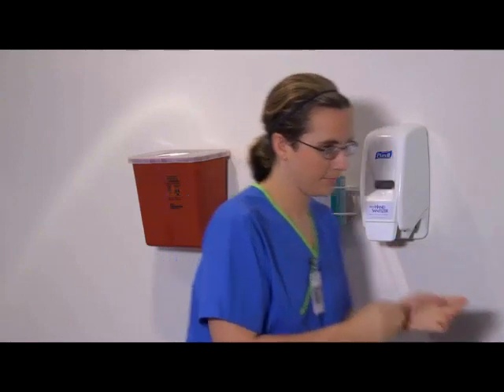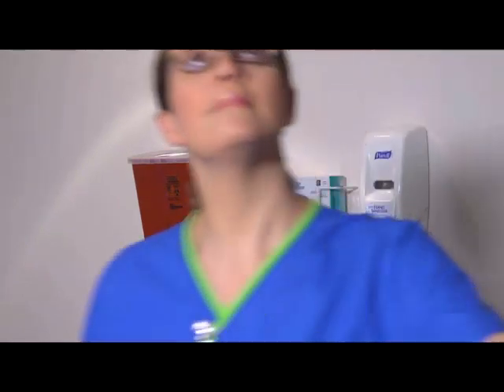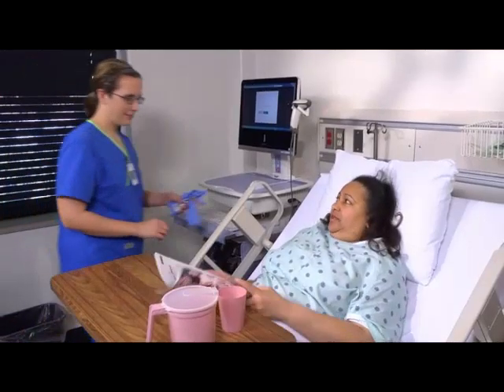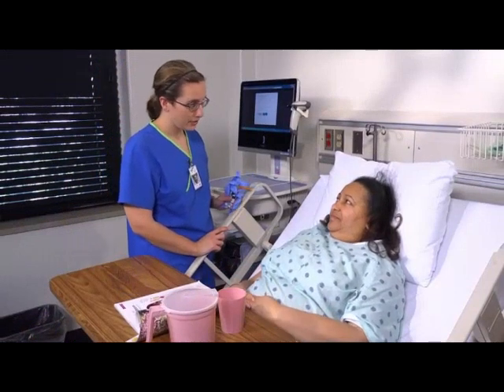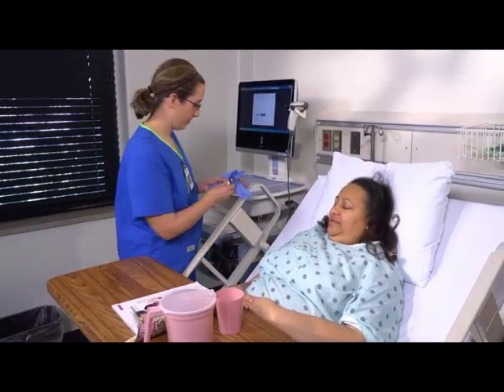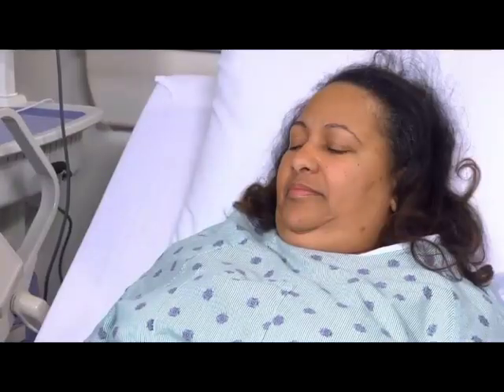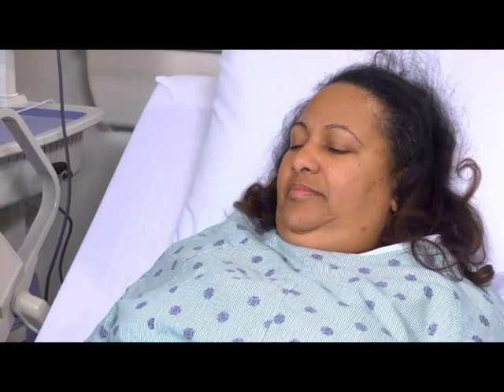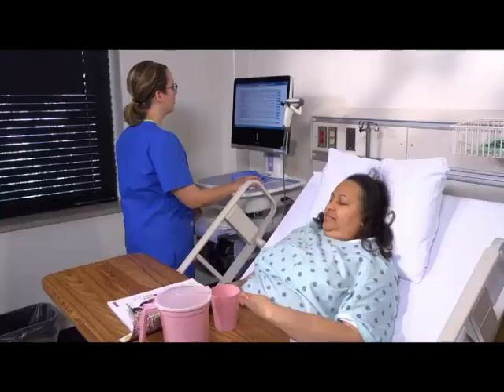After performing hand hygiene and ensuring privacy, introduce yourself to the patient. Hi, my name is Lindsay. I'm going to be the nurse giving you some medication today. Identify her using two identifiers and ask her if she has any allergies.